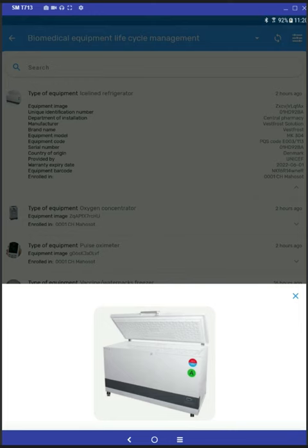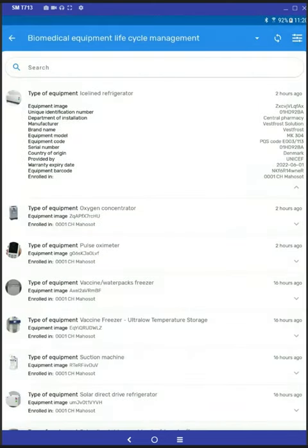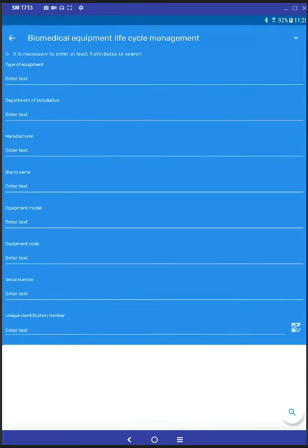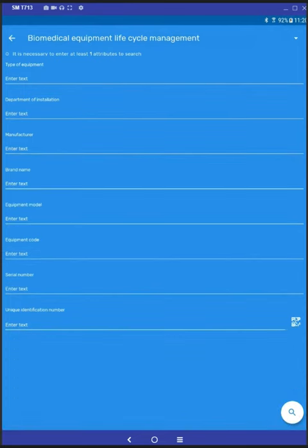Now in order to make an entry for that specific piece of equipment, you can tap on the search bar and tap on the barcode icon all the way on the bottom of the unit identifier. That's going to open the search window on your camera.